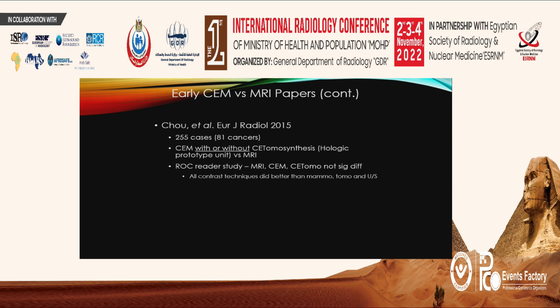And we did an ROC study, and we found that MRI, contrast mammography, and contrast-enhanced tomo were not significantly different. So we didn't find an advantage to contrast-enhanced tomo over regular contrast-enhanced 2D mammo, and also MRI was the same. Now, all of these techniques did better in the ROC study than mammography, tomo, or ultrasound, even when those three were combined.